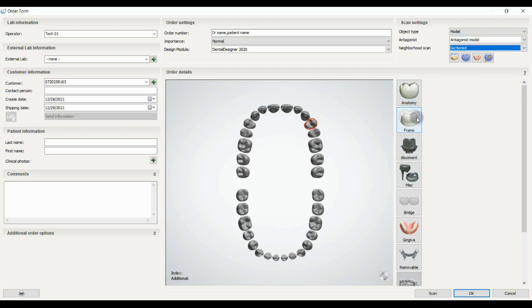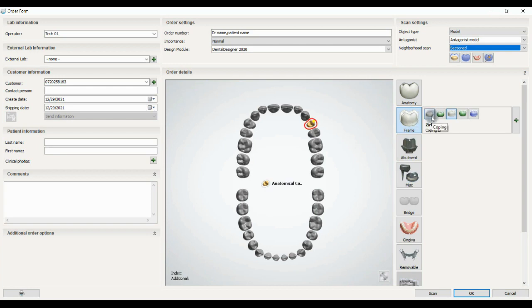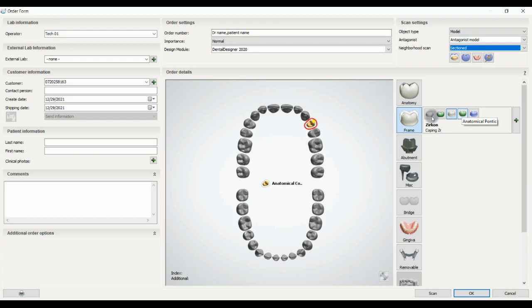The first and the second option is the frame: you can choose coping, coping pontic, or anatomical coping that has the cusps on it, anatomical pontics, and wax-up.